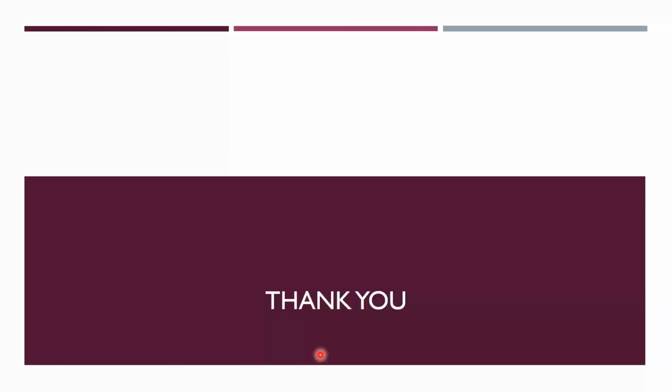We aimed to only regularize the cornea so that the patient will obtain some amount of refractive correction, but we have not aimed for complete correction. Yeah, that's why there is no need to go beyond 400. So you need to be above that safety net of 400 always. Okay, thank you. Thank you so much, sir.